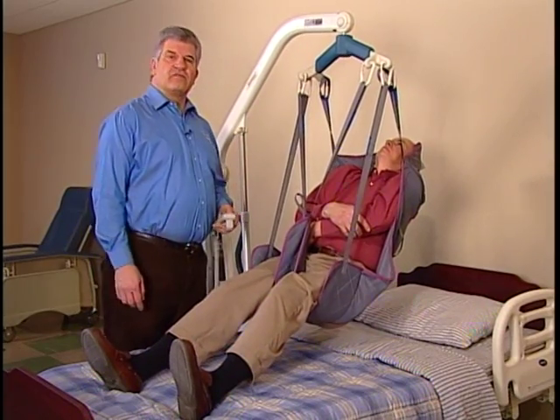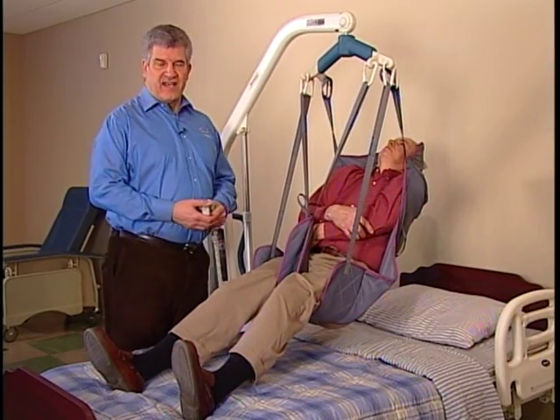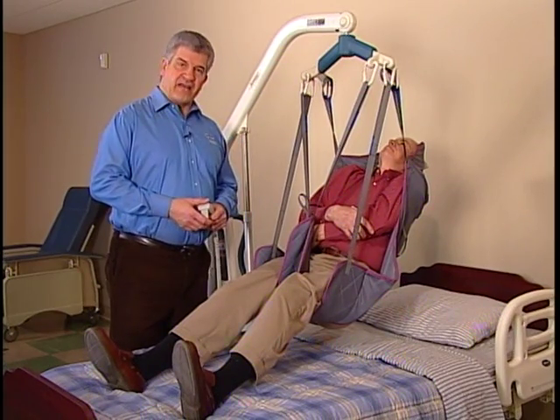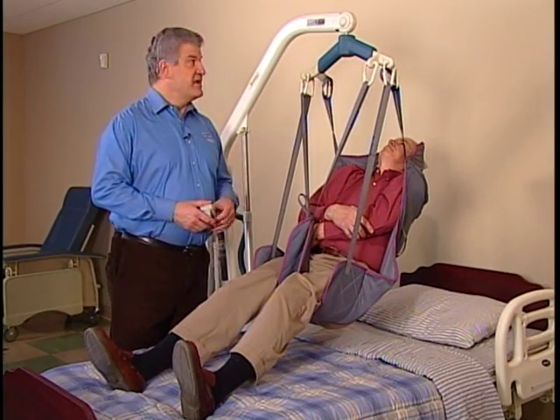Invacare's Divided Leg, Universal, and Easy Fit slings are designed to work with Invacare full body lifts: the Reliant 450, Reliant 600, and Jasmine.